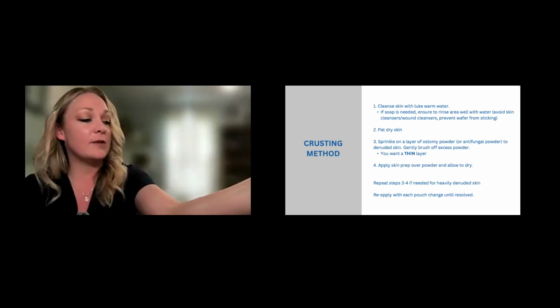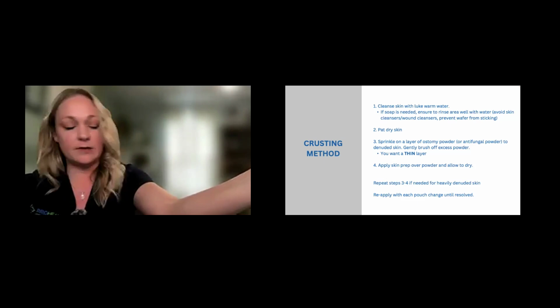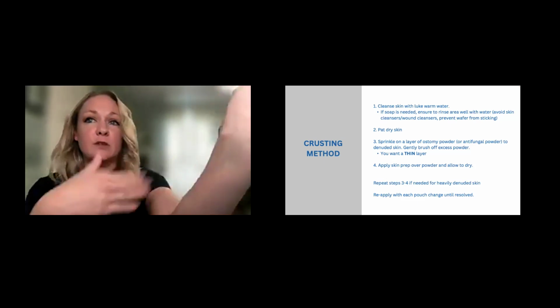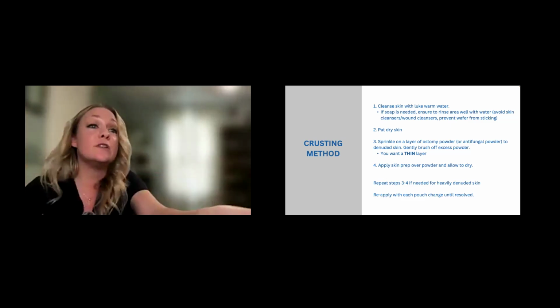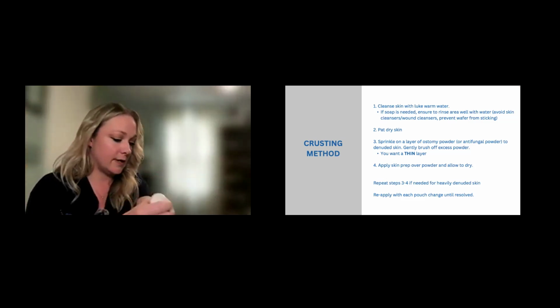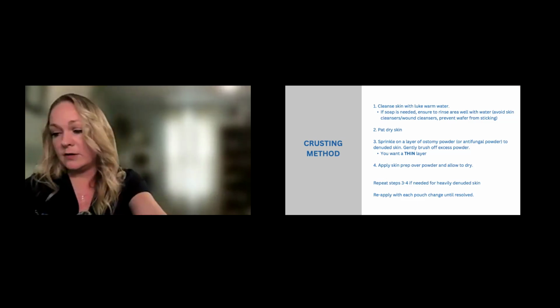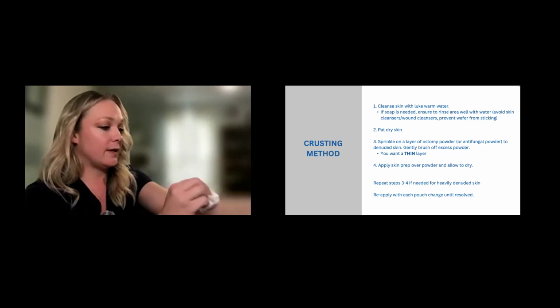So we'll do that. And then we're going to use the skin prep. That's why I like the spray, to just do a nice little even amount there. And you want to make sure to let that dry. And then you can do multiple layers of this. We just want to make sure to always do thin layers so we end up with a crust and not like a big scale, because a big scale will make it pull off.